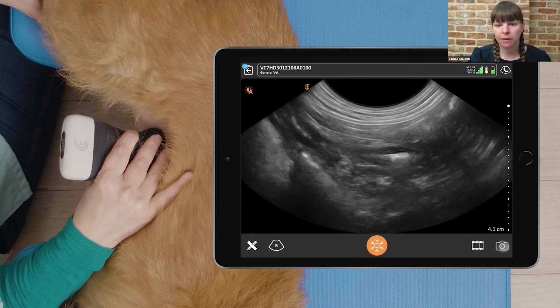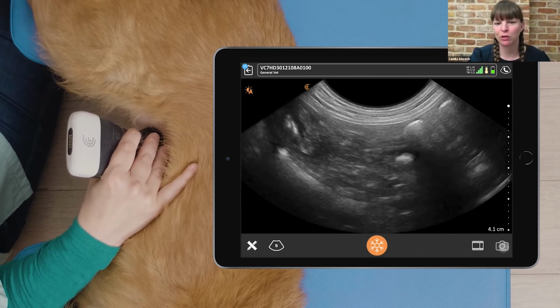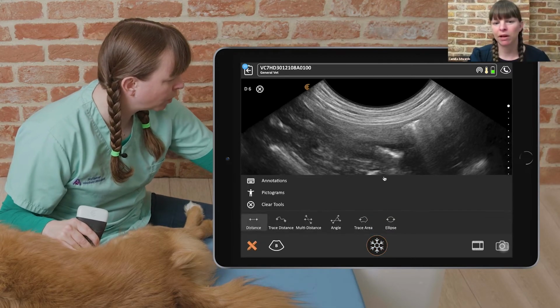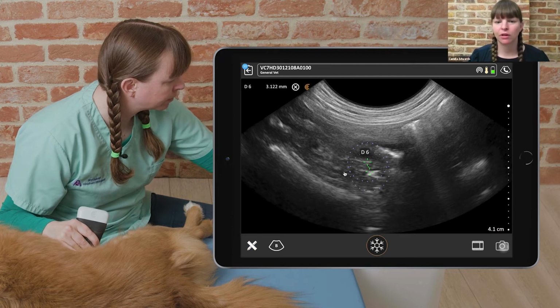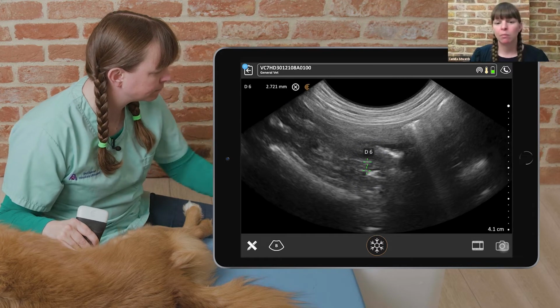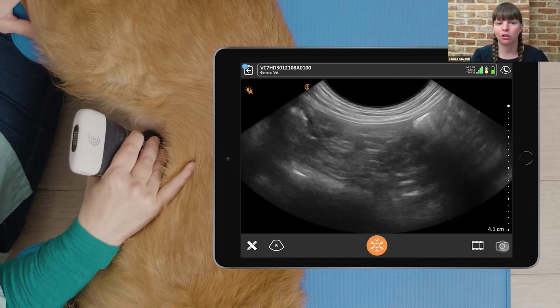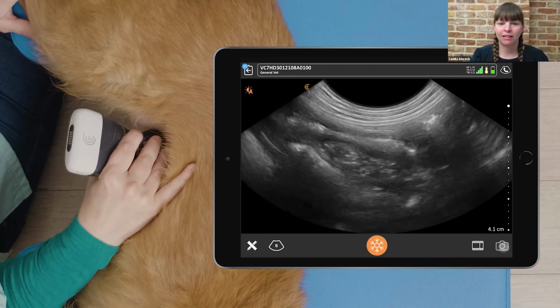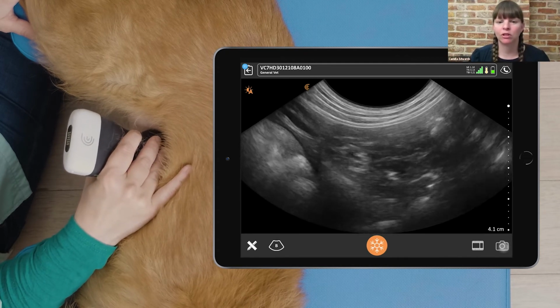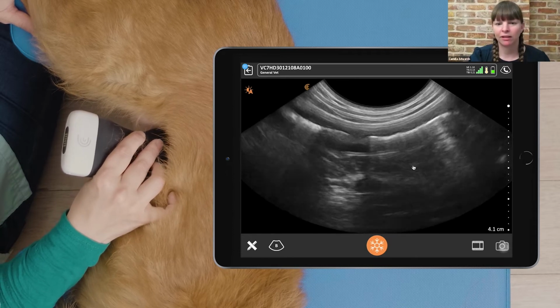In Pippi, she's a normal, healthy dog, so they're not very obvious at all, but they're just popping into view here and here. We have a blood vessel running between them as well, which helps us to spot them more easily. But you can see that they're very isoechoic, very similar to the surrounding tissue. And again, it really does depend on the image quality of your machine to be able to spot these. So again, we're seeing them in this area here.